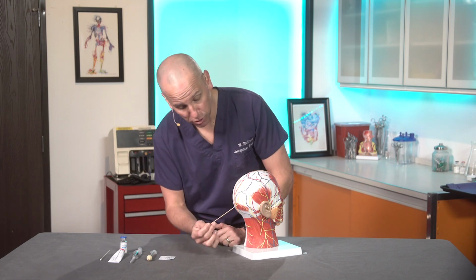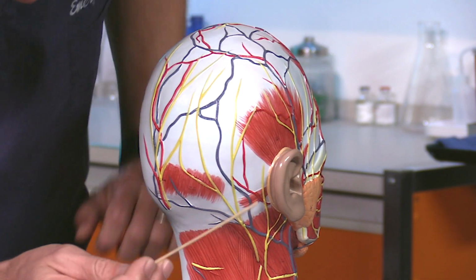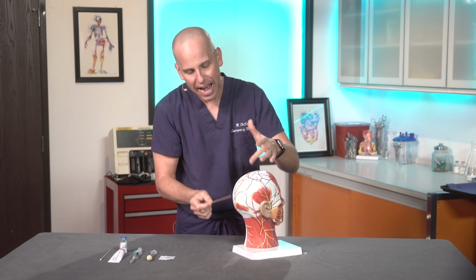The lesser occipital nerve is going to be at that 1/3 cutoff. So cut off here, and you go right here, mastoid process, and it's going to be in this region. The beauty of this nerve block is when we're doing it, we're going to be fanning our anesthesia anyway, so you're going to be trying to get that nerve as it cruises up towards the scalp.